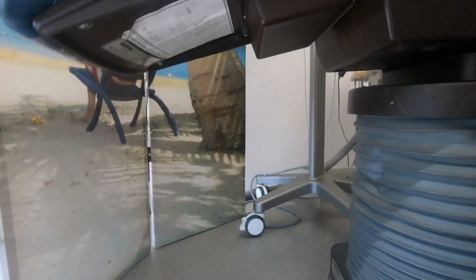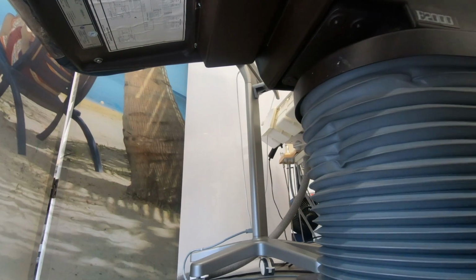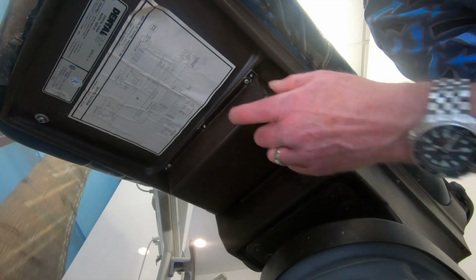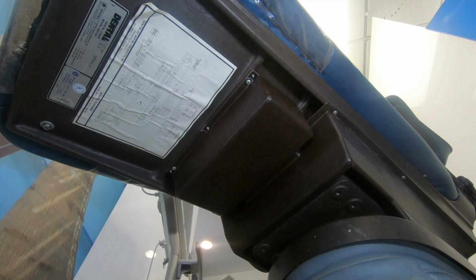So as the camera moves towards the back, you'll be able to get a look and see the wiring diagram underneath the chair, which they don't really provide anymore, but that's great. It shows you exactly which wire controls which motion in the chair. So I just got to get that box off, and that's it.